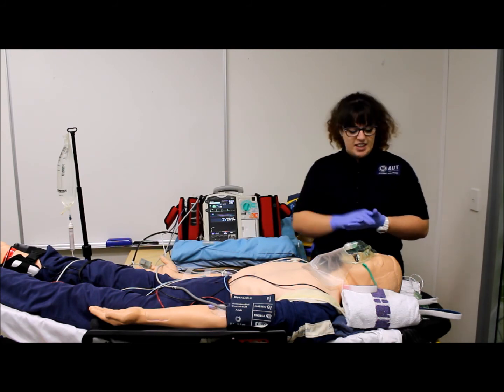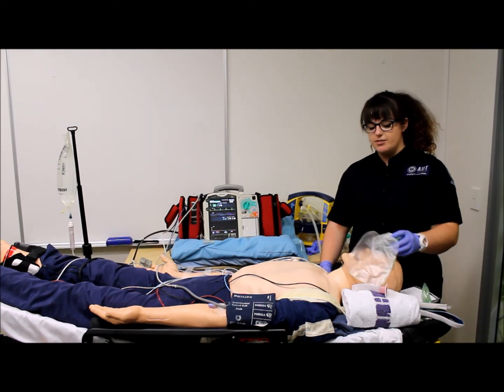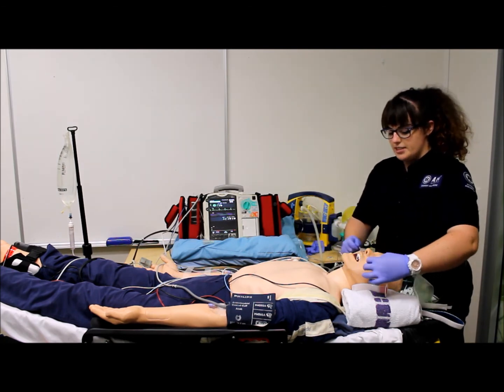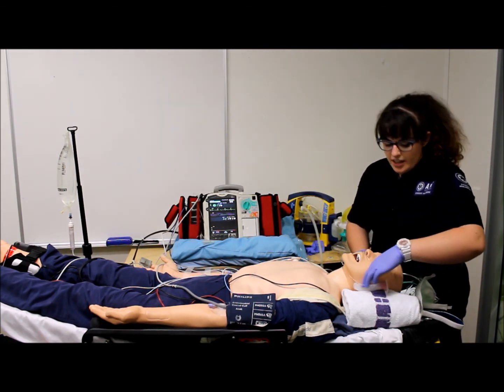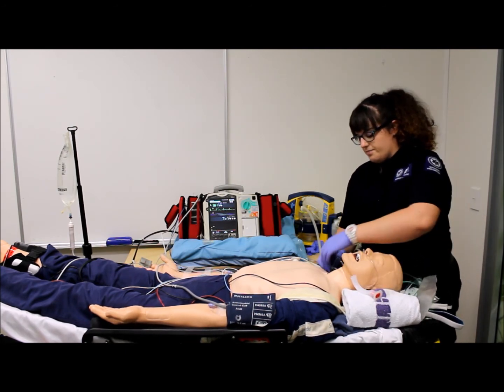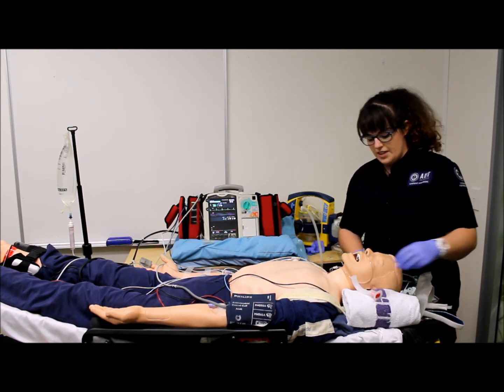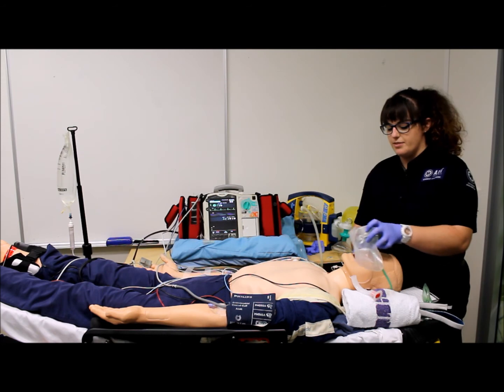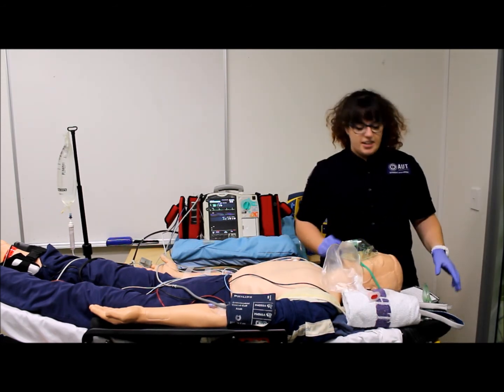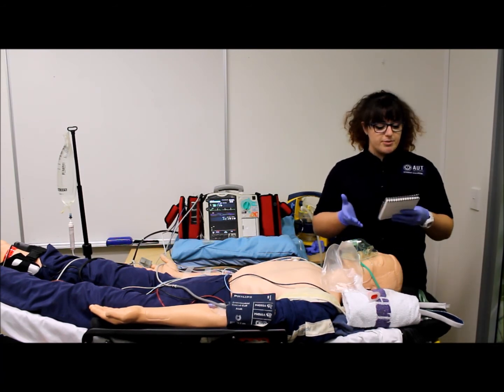Copy. Right, so now we can go through our RSI checklist. So we're going to remove this reservoir bag for the moment, and we are going to place the naso prongs in and ready. Okay, and place the reservoir back over the patient. Now, we are pre-oxygenating at 10 litres per minute via our reservoir bag.